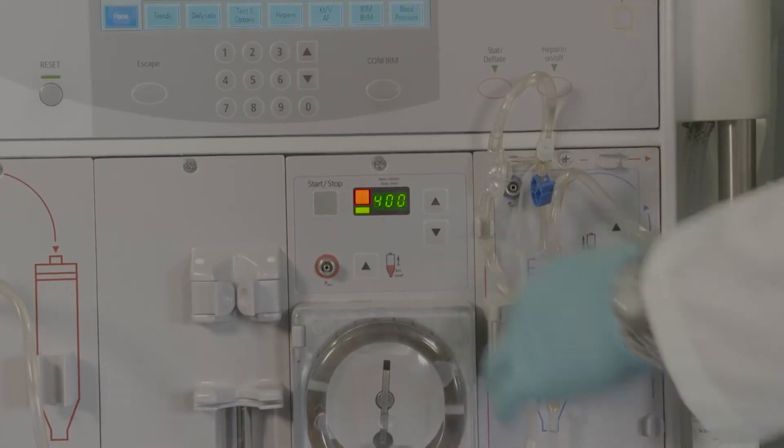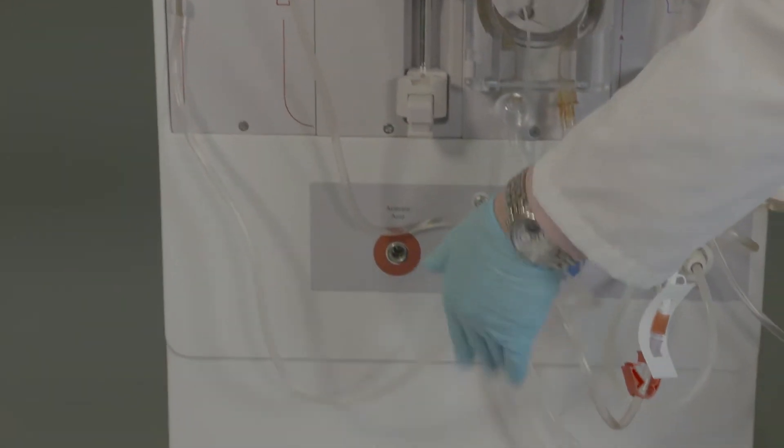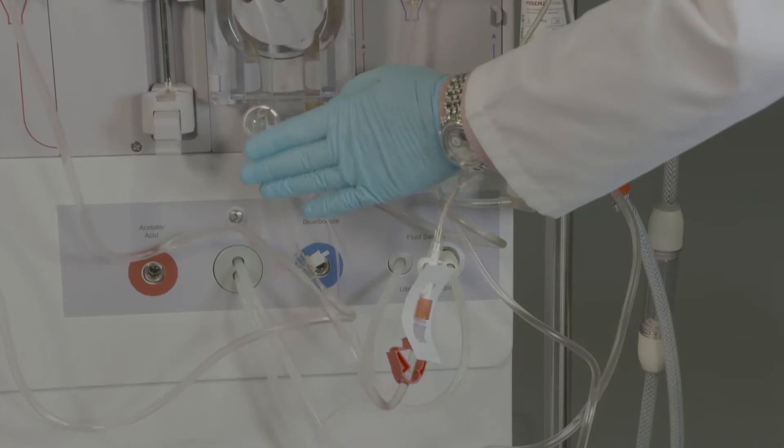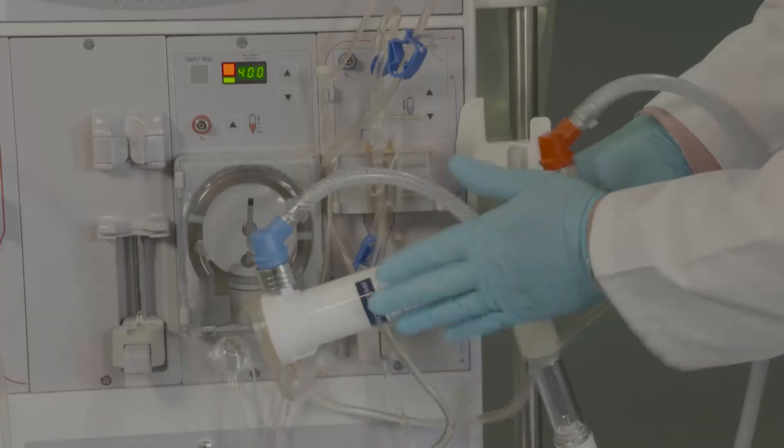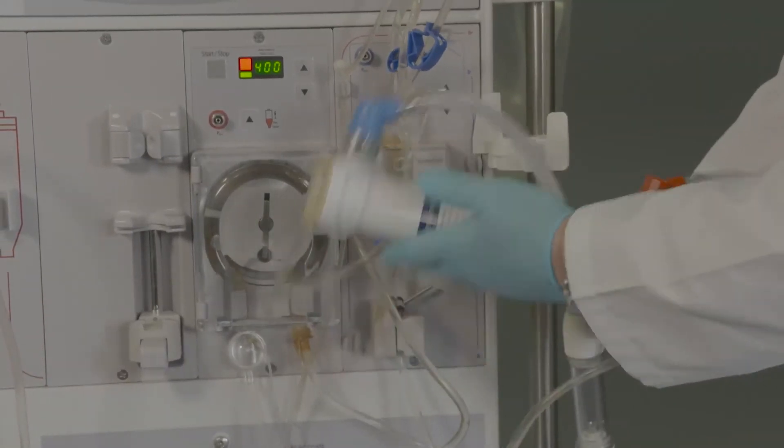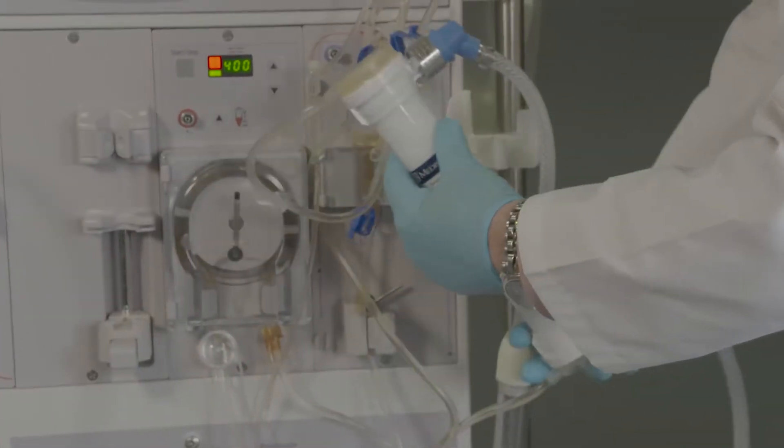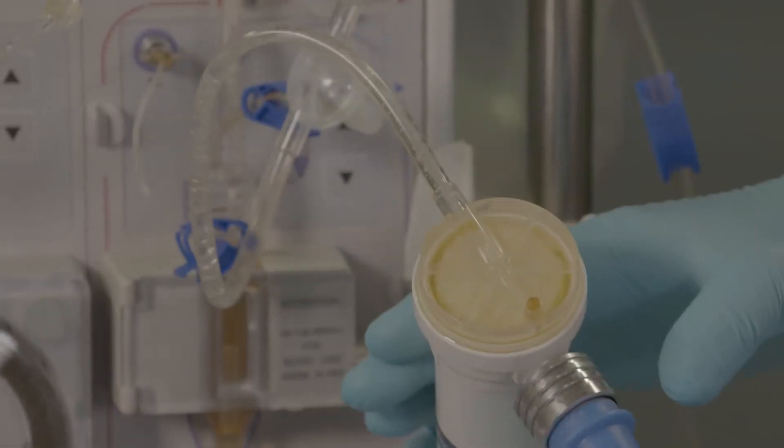In order to dislodge air bubbles in the circuit, tap the arterial line and arterial pod two to three times during the recirculation mode. Tilt the venous port of the dialyzer to approximately the 10 o'clock position with the dialysate port tilted upwards.